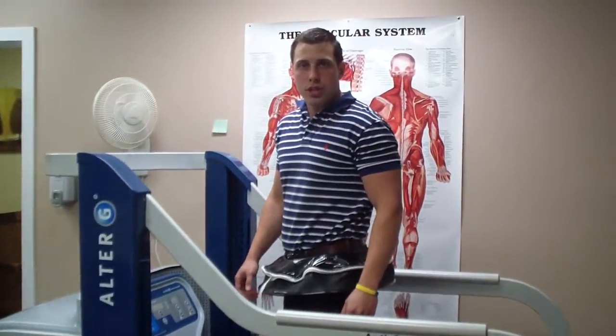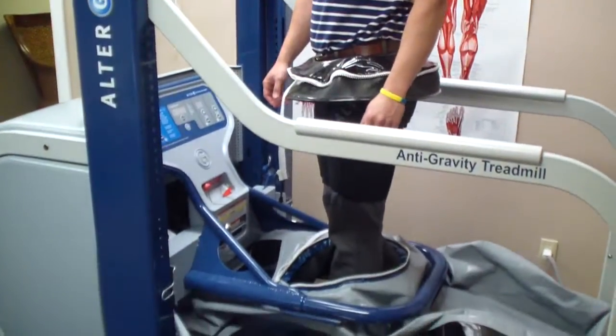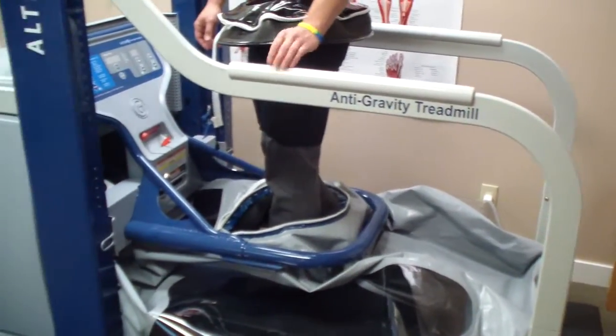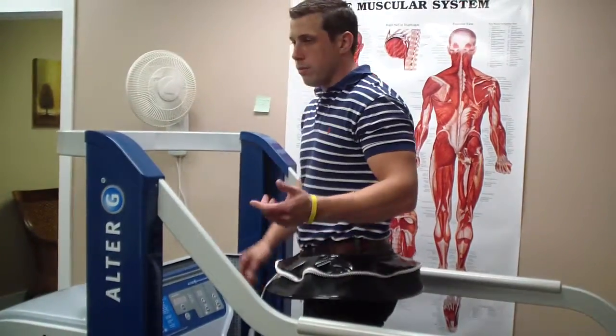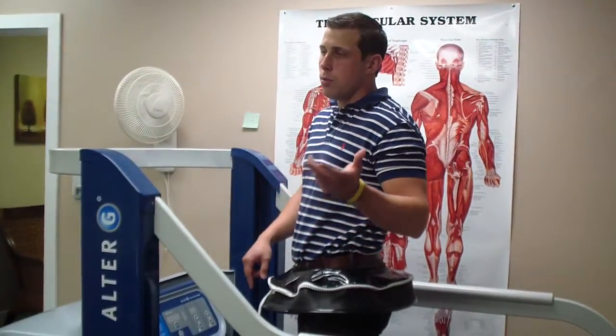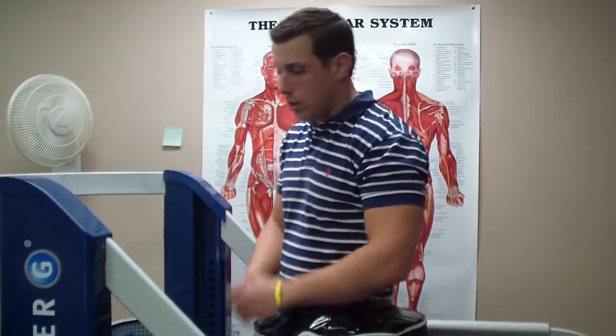This is our Alter-G anti-gravity treadmill, built to take up to 80% of your body weight off of you. It has many different uses, all the way from geriatrics to neuromotor issues like Parkinson's, cerebral palsy, weight loss, and also performance — for people who want to add miles while already running 80 or 90 miles a week without banging on the joints.